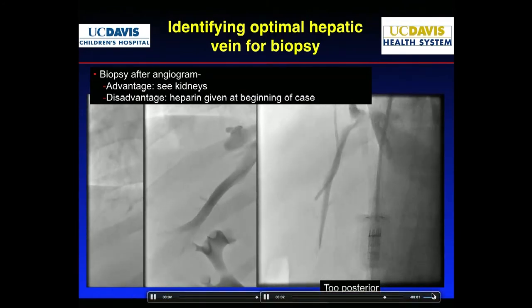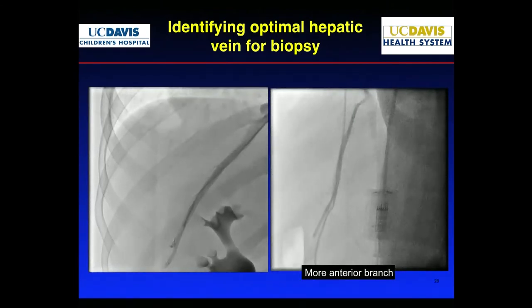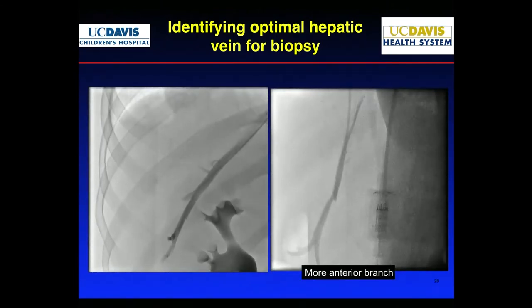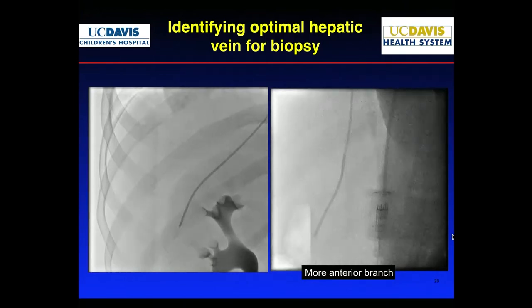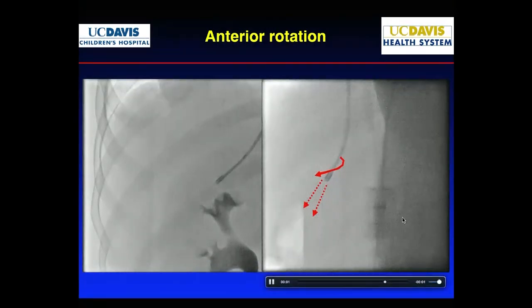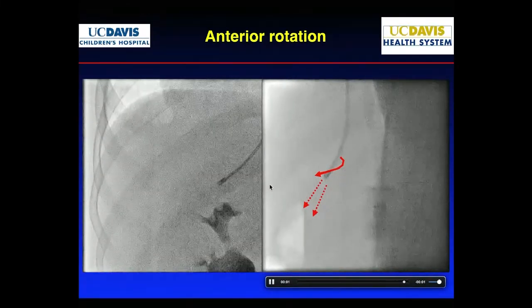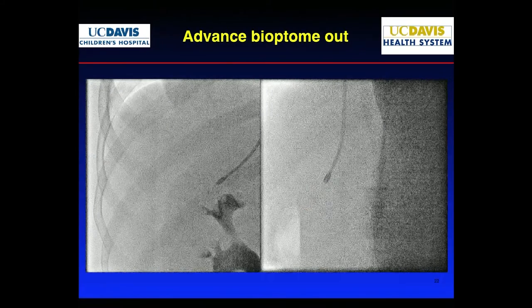So we did a few things, and we looked for a few vessels here, and again, I show you the different parts. Again, trying to find the segments where you could position the biopsy system in the best place away from any of the important structures like the kidneys. Now again, you notice that as we rotate, we're changing the angle so that it stays a little anterior. Again, if you look at the AP view, you'll think you're going to hit the kidneys, but the kidneys are back here, so we're not near them on the lateral projection.